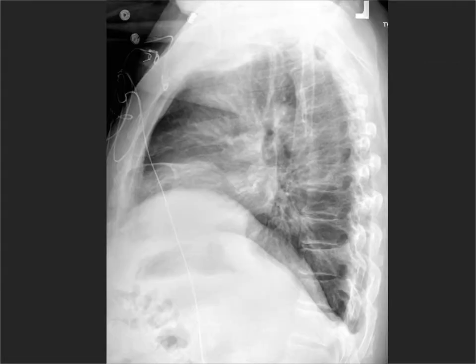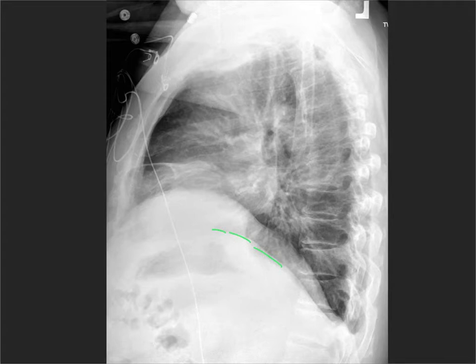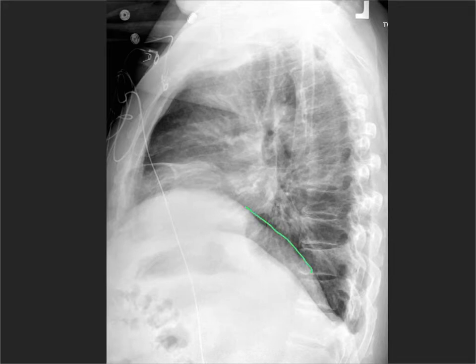The heart sits on top of the anterior part of the left hemidiaphragm, so the left hemidiaphragm is going to fade out anteriorly at the level of the heart. Conversely, the right hemidiaphragm in most patients you can see all the way into the retrosternal space, like this.